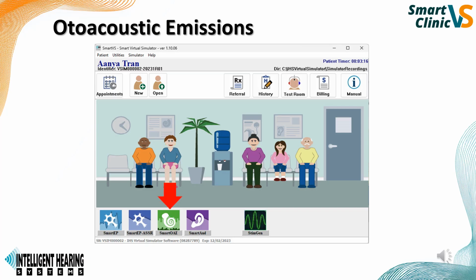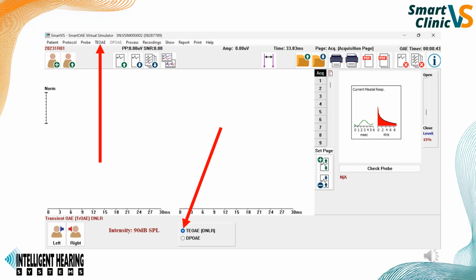Once the probe has been placed into the patient's ear, move the testing room so that you can see the Smart OAE icon on the screen. Once the Smart OAE module has been initiated, choose to do either the TE or the DPOAE. We will start with the TE-OAE first. Make sure that the button has been chosen on the bottom bar.